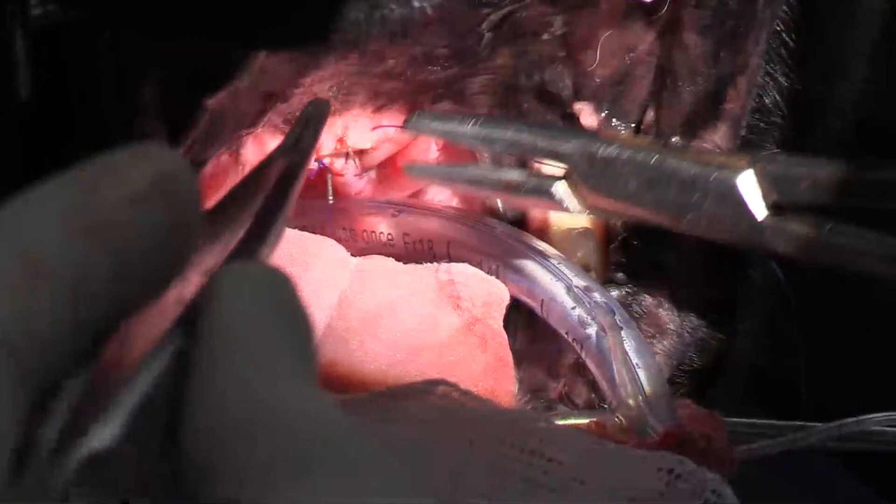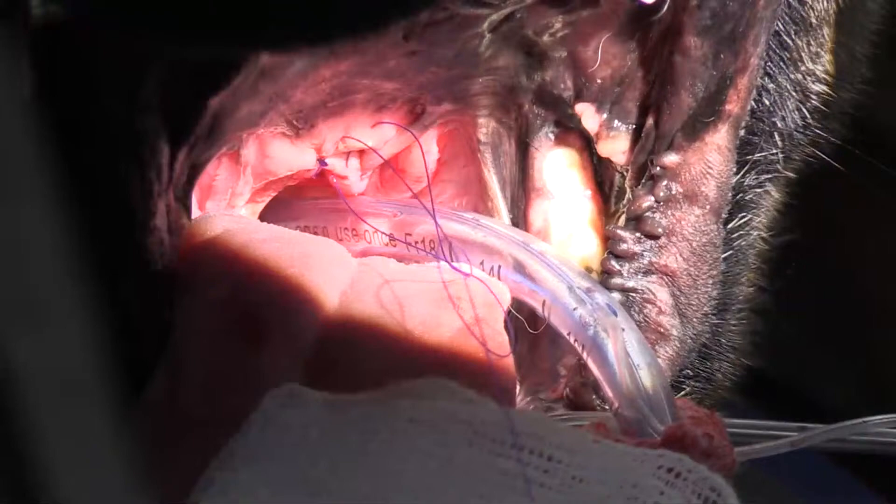When I'm finished with this I'm going to check and excise the laryngeal saccules, but I won't be able to video that because it's just too hard to see.